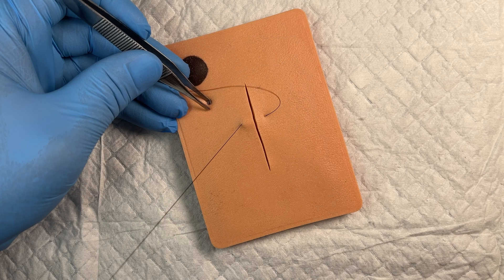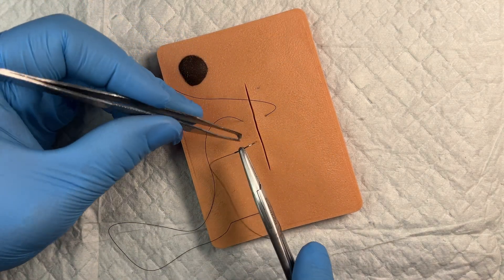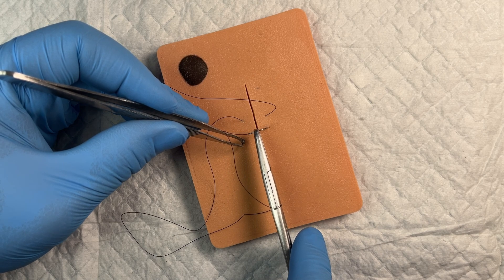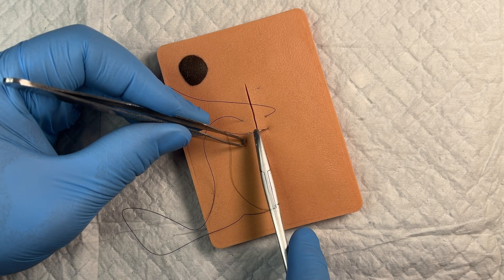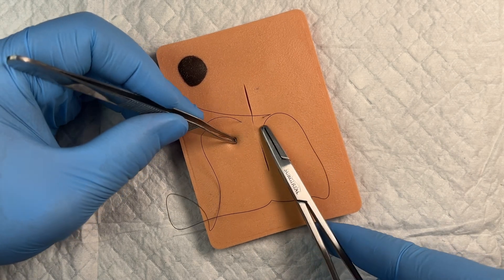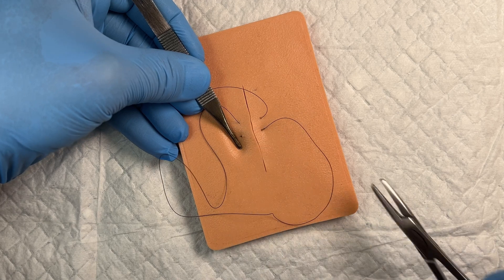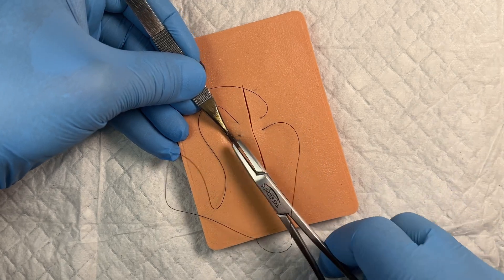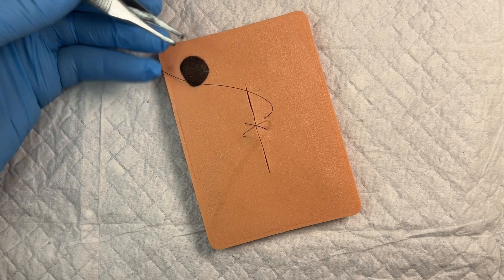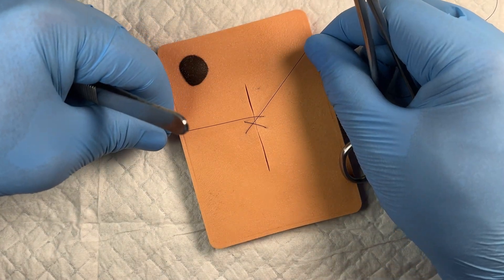I'm going to pull this somewhat of the way through, and then rather than finishing off there, I'm going to go down about three quarters of a centimeter to one full centimeter and do the exact same thing. Pull through here, and notice how it pulls through and lays across like that — that's where the name figure of eight or cruciate suture comes from.